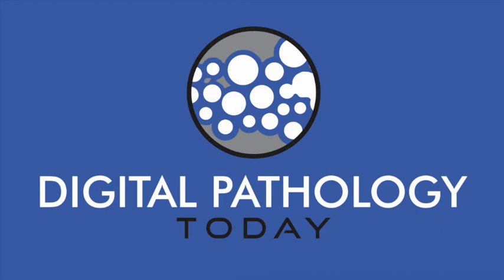With the FDA, we will be developing, and we are developing actually, we have submitted the first draft of the manuscript to a journal with a limited set of data just to show the principle. That what we want to do is not so easy, because the first step towards a calibration of digital pathology tool is what is a lymphocyte and how good are pathologists in annotating the same lymphocyte. And that's the first step. And now we have shown with data that this is not so straightforward.